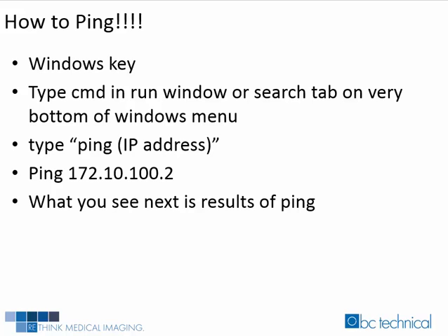First, click the Start button in the bottom left-hand corner of the screen. Second, click the Run option in the right-hand column. Type CMD in the text box and then hit the Enter key on your keyboard. A black box with a flashing cursor will open. This is the command prompt. Type ping and then hit the space bar on your keyboard. Type in the address you'd like to ping and then hit the Enter key on your keyboard. Then you just wait for the ping results.